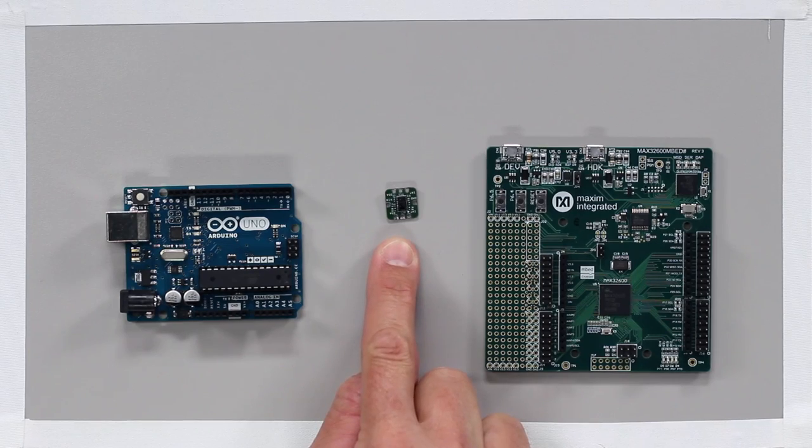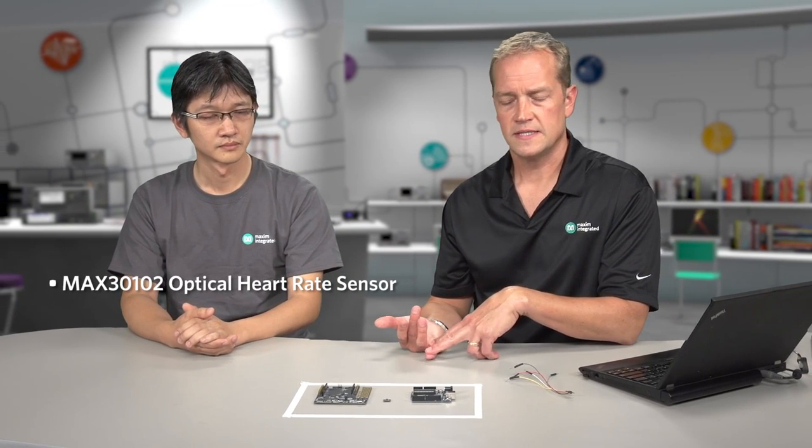So the board that we're talking about here is the MaxRefDes 117. It's this tiny little module in the middle of the screen here where I'm pointing. And it's a heart rate monitor. So what it's got on it is our MAX30102, which is an optical heart rate sensor chip. It actually has integrated red and IR LEDs, so it's a pretty nice solution there. It's got I2C out, so it's all fully contained from optical all the way to digital.